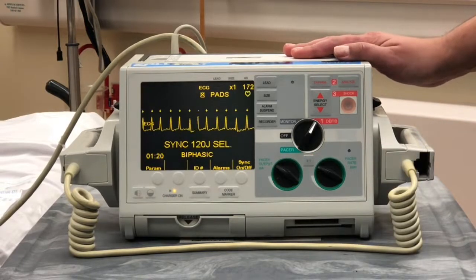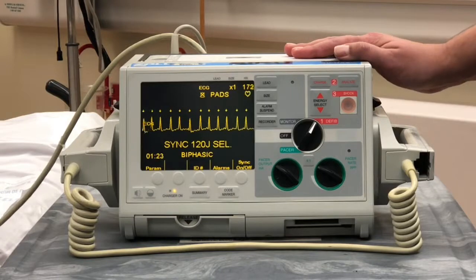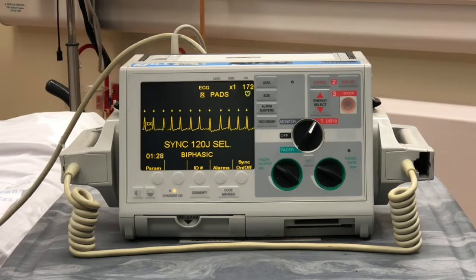As we've pressed the sync button, we can see that we have a dot on top of each QRS, and the machine will be able to deliver the energy at the appropriate time in the ECG cycle. It's important to note that the two steps to ensure a safe cardioversion are to make sure that we have the sync button on, and not only do we need defibrillator pads on the patient, but we need to have the 3-lead ECG applied along with the pads to make sure we're successful.